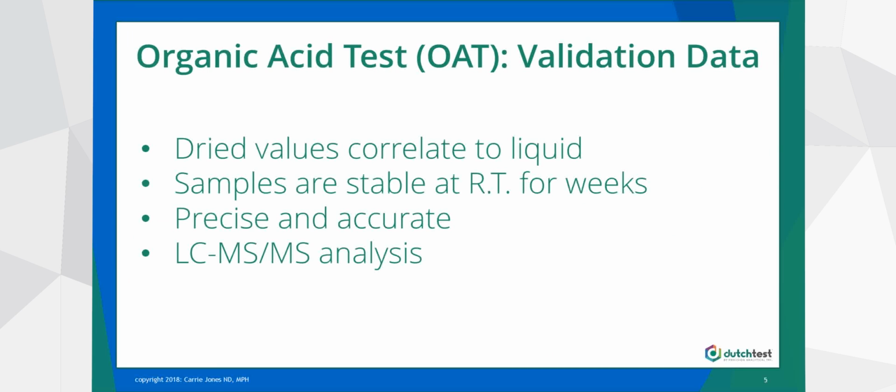They're stable at room temperature for weeks, and the method that we're using happens to be LC-MS-MS. There are a few options for organic acids, and I've developed these assays by several different methods, and we find that to work the best in terms of precision and accuracy.